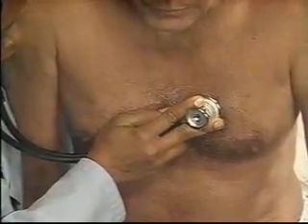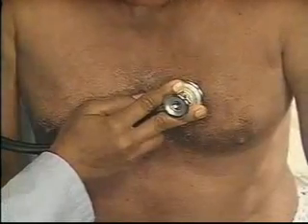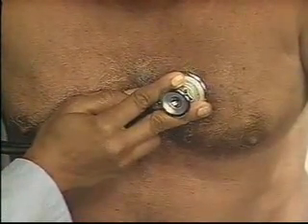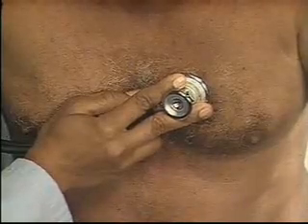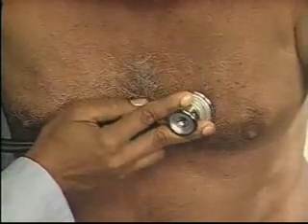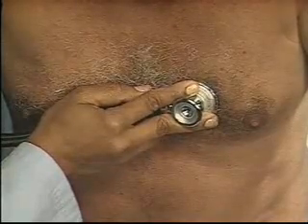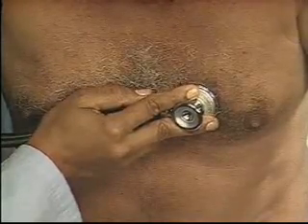Using the diaphragm of the stethoscope, listen at the left second interspace and down the left sternal border to the apex. Breathe out completely again and hold it. Pause periodically to allow the patient to breathe. Listen for the high-pitched diastolic murmur of aortic regurgitation.